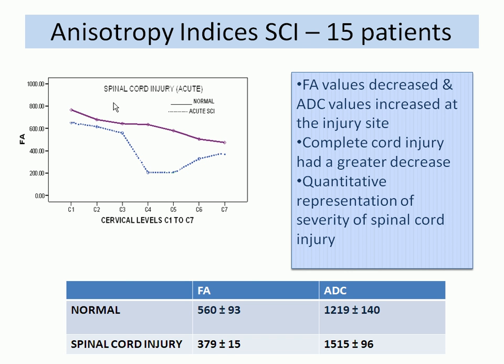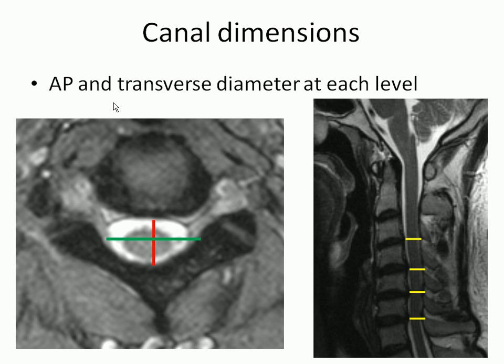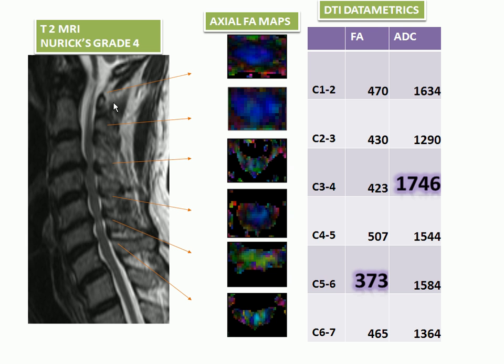Now you find here that in the first study we did in spinal cord injury, wherever there is an injury, there is a complete dip. And we were also able to show that these patients had the same maintained dip in patients who did not fully recover. Now we also found it has additional value in cervical spondylotic myelopathy also.